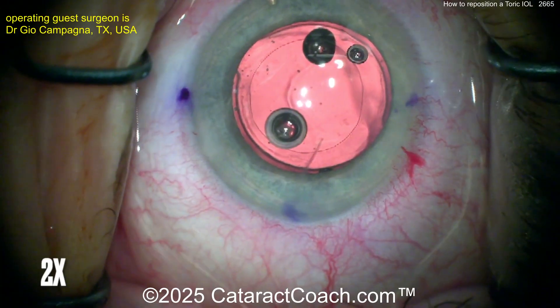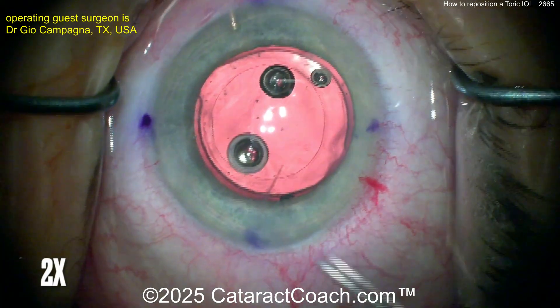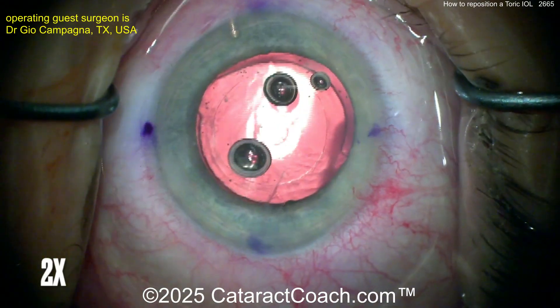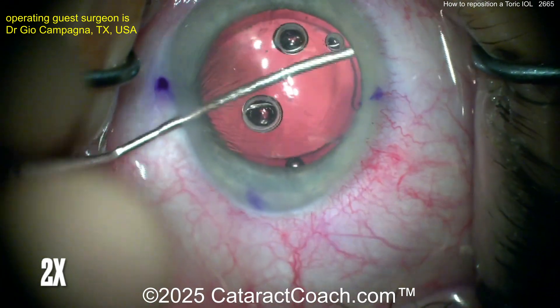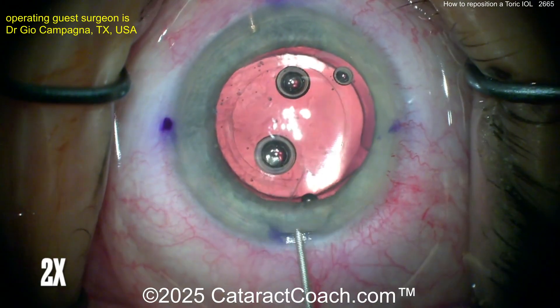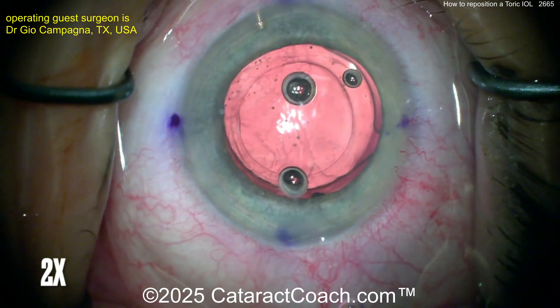Why did the lens misrotate in the first place? The most common reason is that the surgeon left viscoelastic behind the optic. That viscoelastic between the posterior side of the optic and the posterior capsule acted as a lubricant and allowed the lens to shift or rotate. Another reason: if the patient has a flattening of the anterior chamber in the post-op period — say the incision didn't seal well — the lens shifts, then the AC reinflates as they make more aqueous, and the AC the next morning may be fine, but now the lens has shifted.